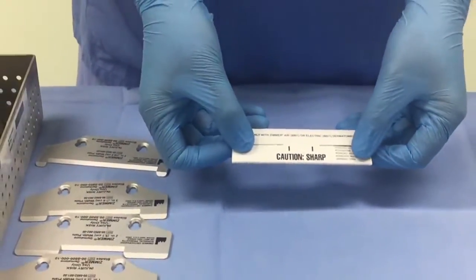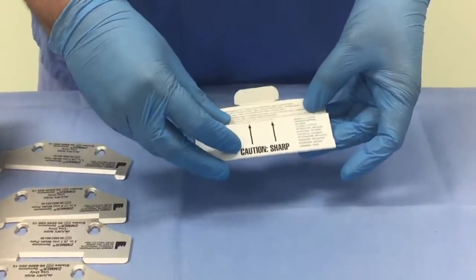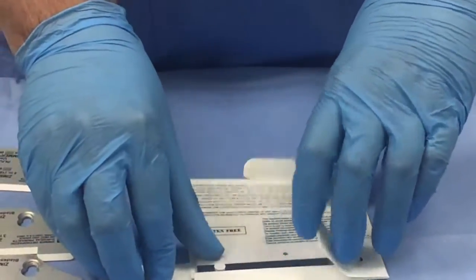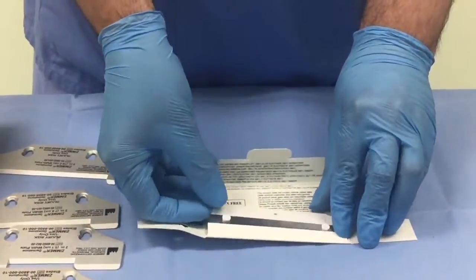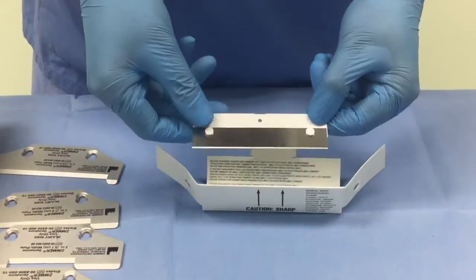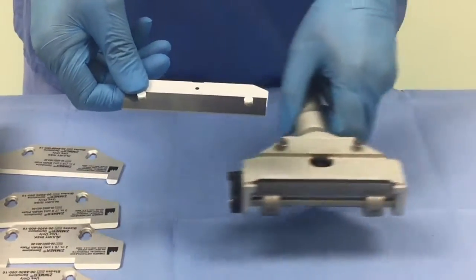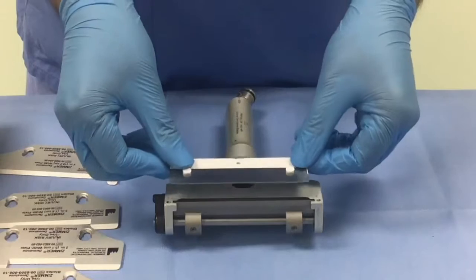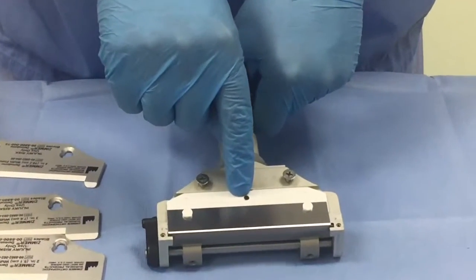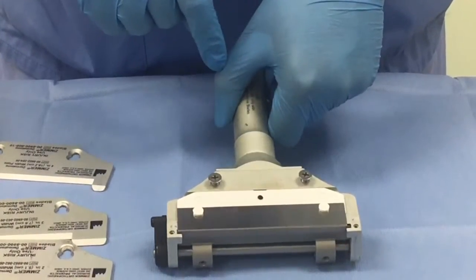The dermatome blade — be very careful when handling it to avoid a sharp injury. When you open it, always handle it at the base where the plastic strip is. It is very clearly marked: insert this side up. It has got a central hole which corresponds to the lever in the middle of the base of the dermatome. When it sits in that lever, the blade sits flush to the base of the dermatome.